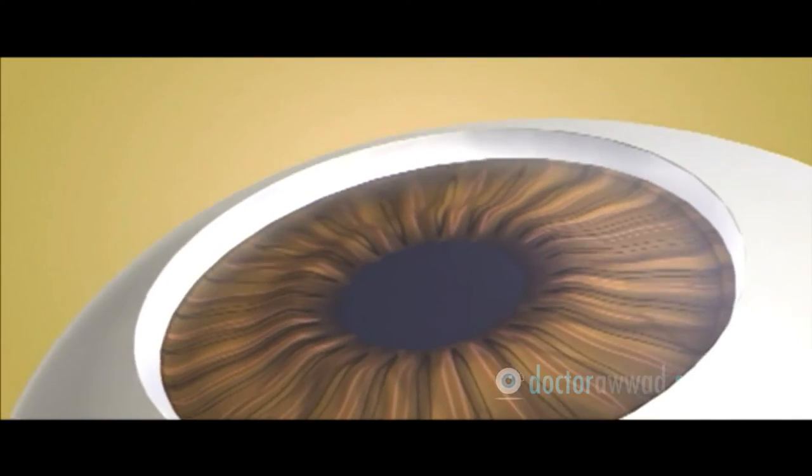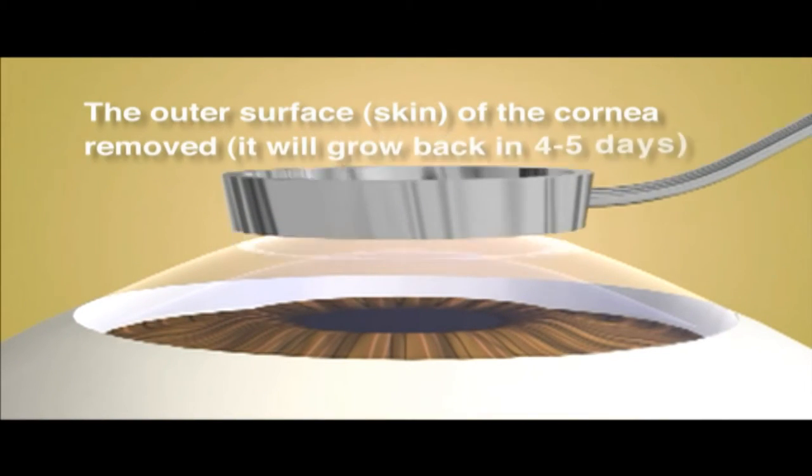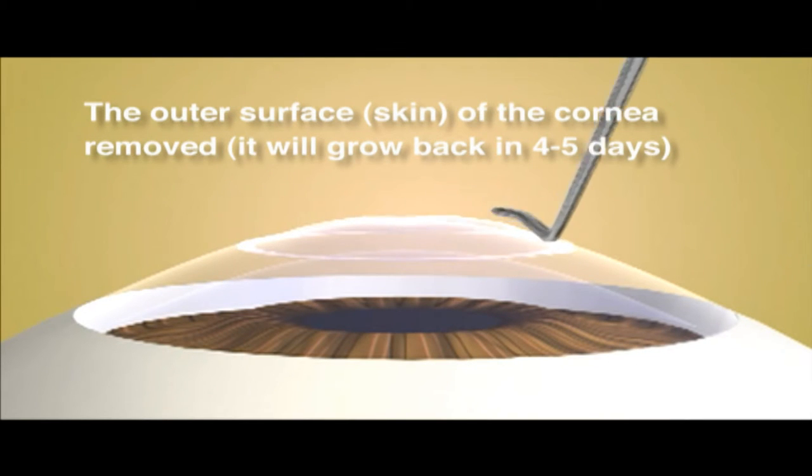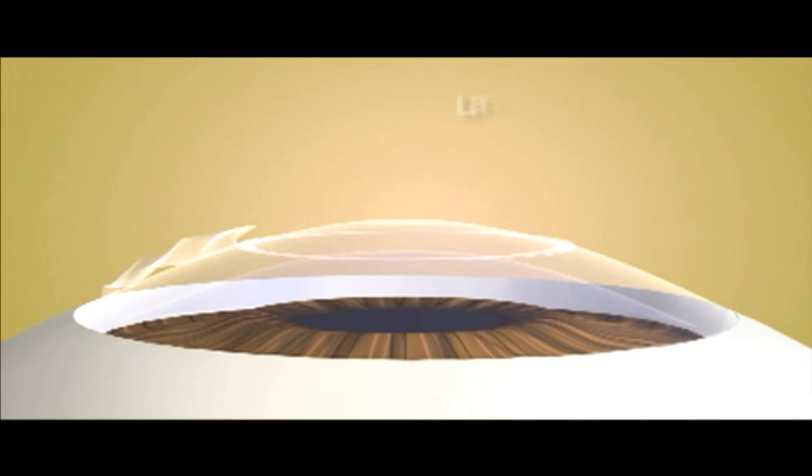With PRK or laser surface ablation, the epithelium or outer surface skin of the cornea is removed. A computerized excimer laser is applied on the cornea to reshape it. The laser removes tissue to either decrease the curvature of the cornea to correct nearsightedness.